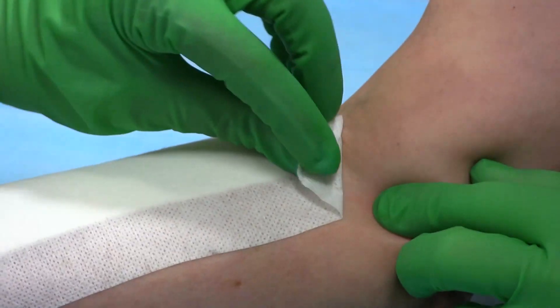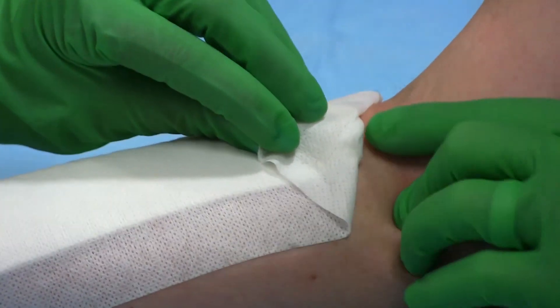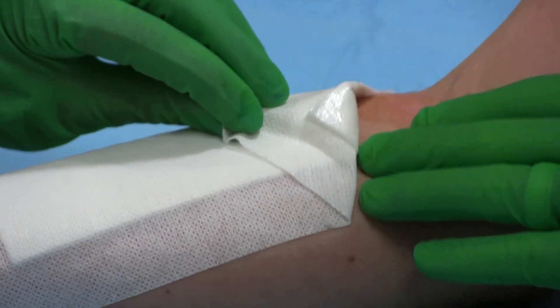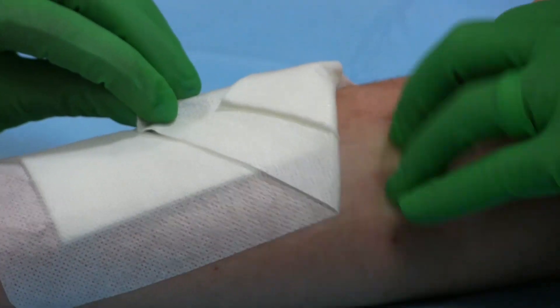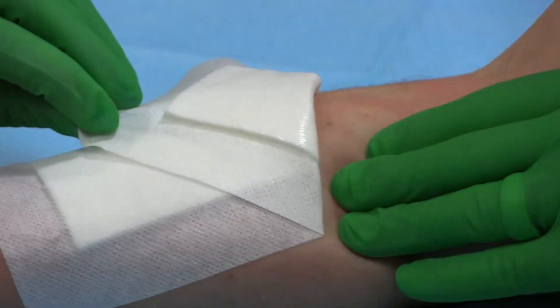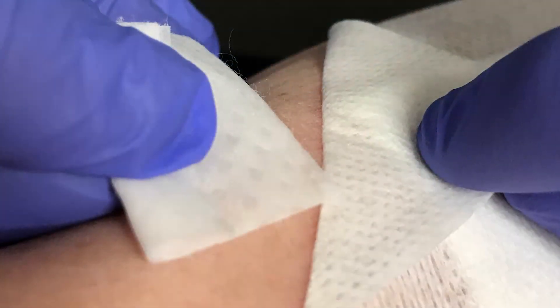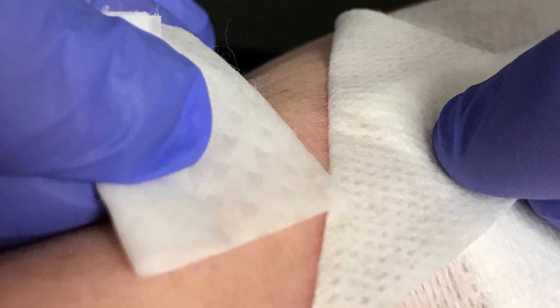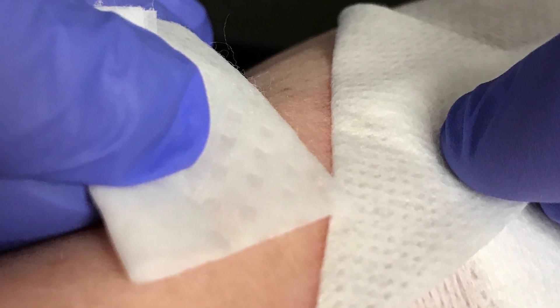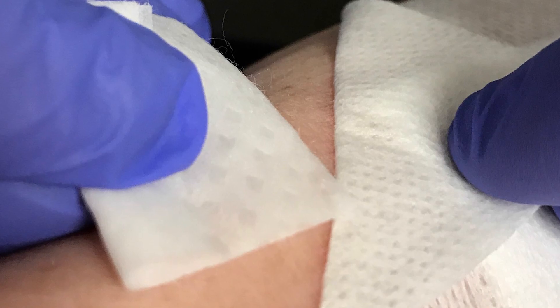Remove the dressing slowly. Pull the tape over itself at a 150 to 180 degree angle to the skin. Place an index finger along the peel line to provide counter-traction. If the tape is strongly adherent to the skin, an adhesive remover or skin moisturizer can also be used to dissolve the adhesive at the peel line.